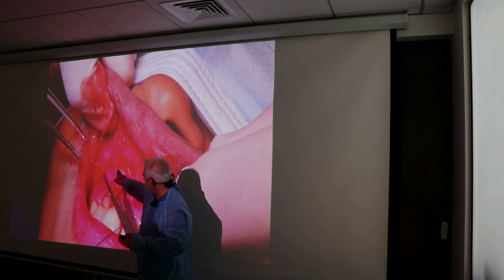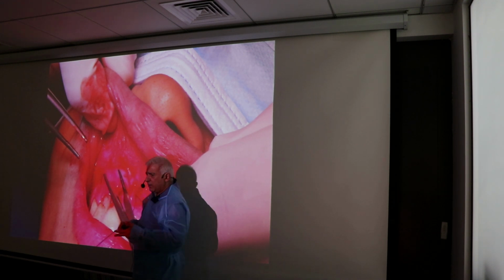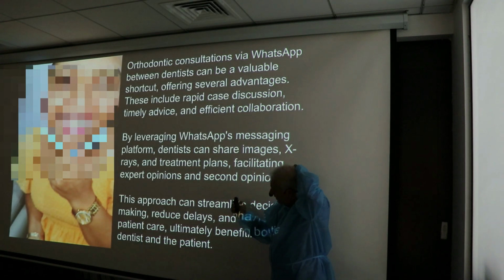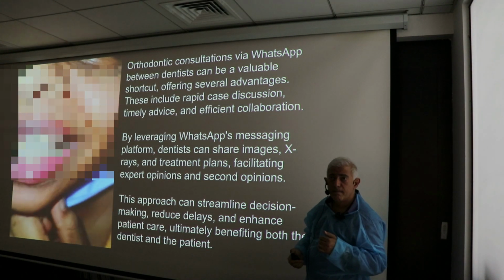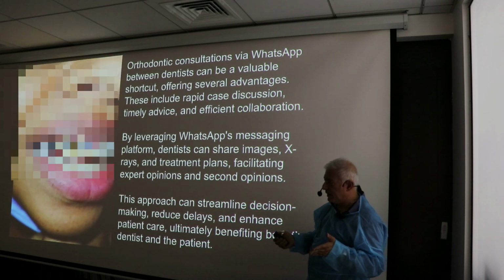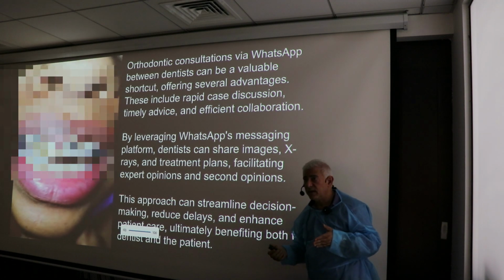So once you feel this tip, you know, because you can feel it with your finger, you know you're coming out from the other end. This is, let me increase the volume. Why is there no volume? Basically, nobody's here, okay.